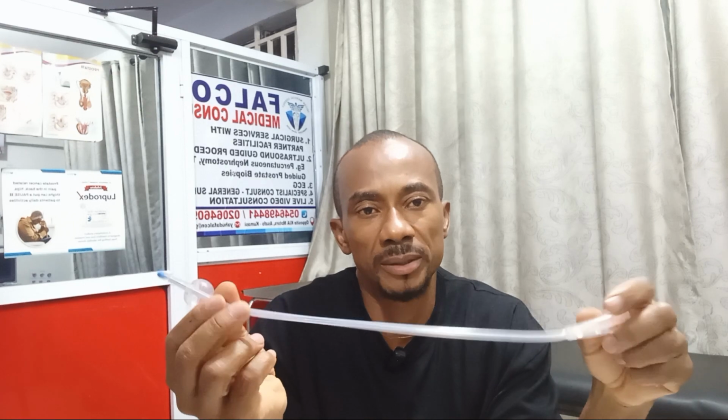What I've tried that I would recommend is that you can use an ultrasound guided approach via the suprapubic region. So it's a trans-abdominal approach, ultrasound guided, and then percutaneously advance a 21 gauge needle or a spinal needle or any length of needle that can traverse the anterior abdominal wall, get into the urinary bladder, and then we burst the balloon directly under ultrasound guidance. And that I've done several times with success. So that's what I want to speak to today.